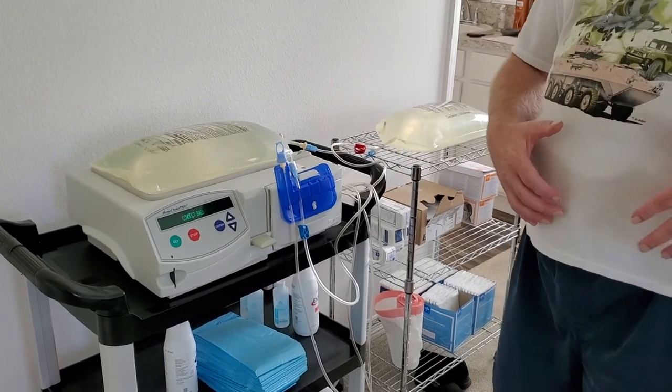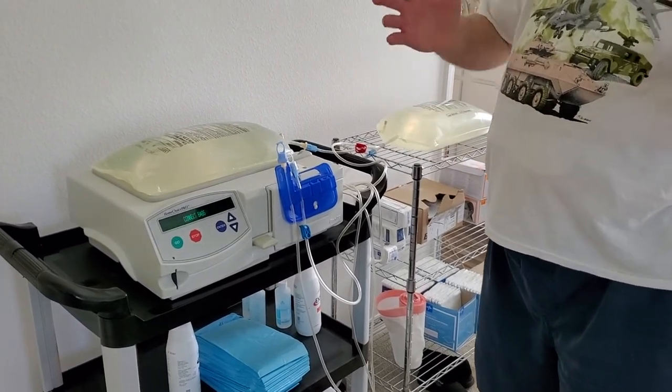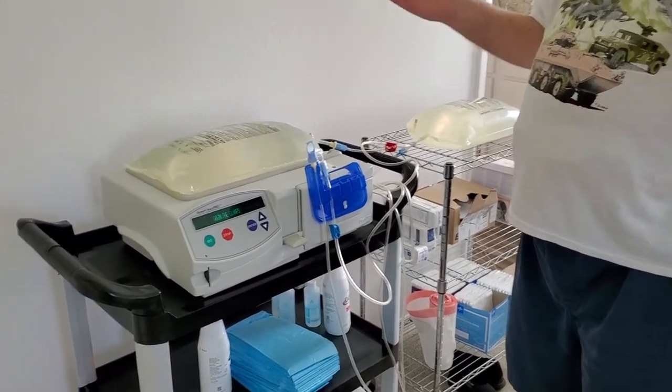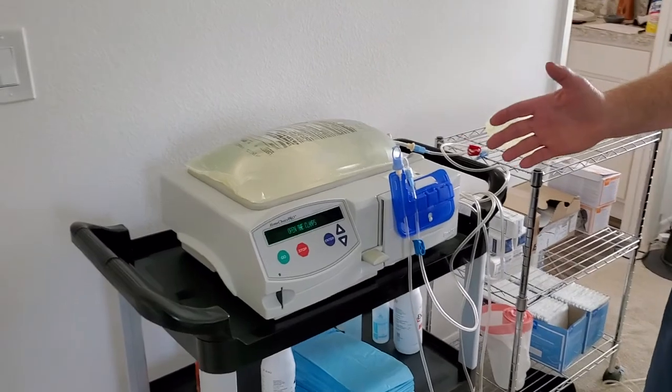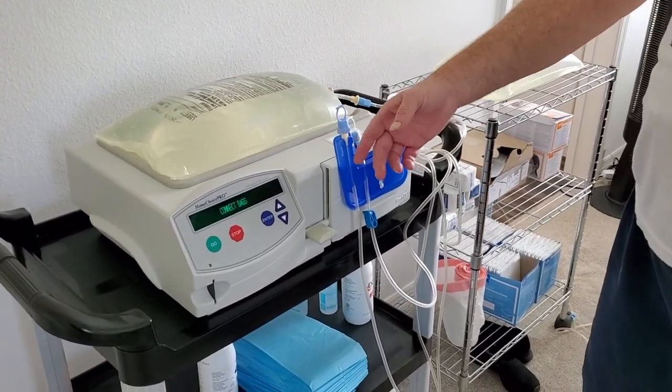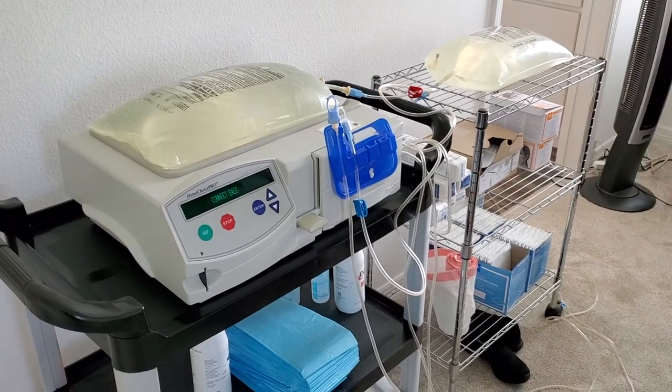So while it's repriming, you can go ahead and bandage yourself up, however your process works. It's just an extra way to be careful. Once it beeps again, make sure the prime is all the way up to the top.